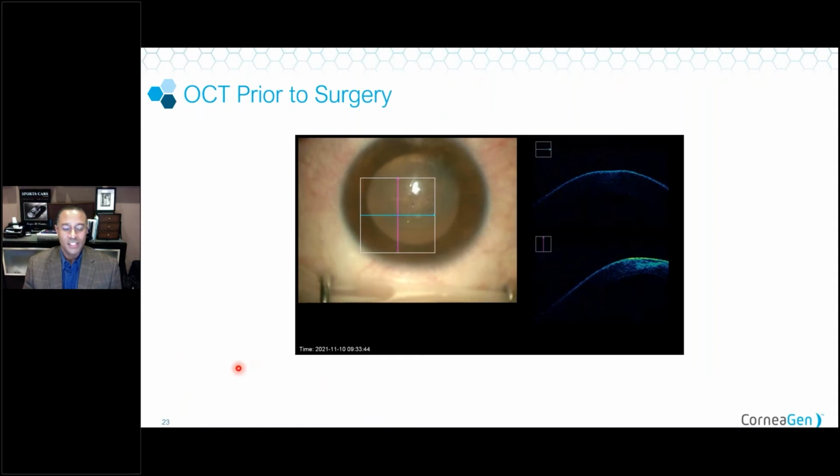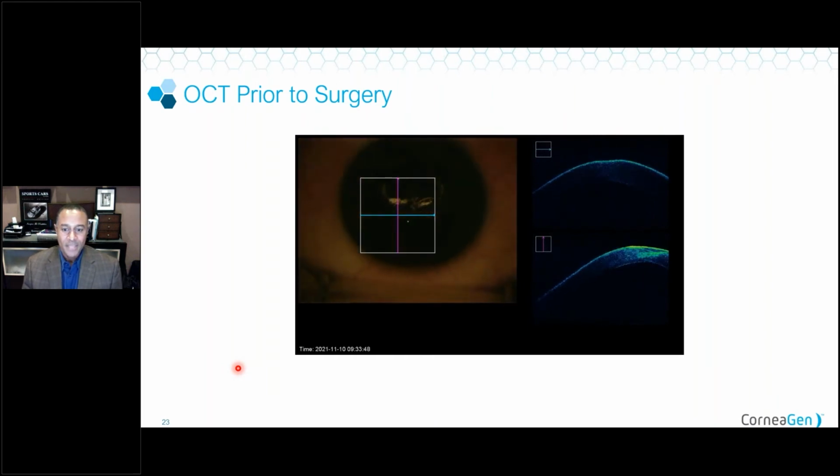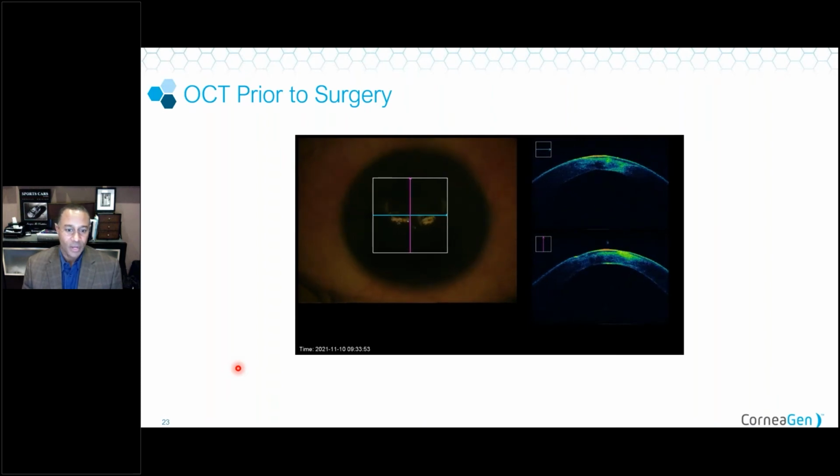So this is an OCT of that 33-year-old patient that we discussed. As you can see in the OCT run here, you can see the scarring in the anterior stroma, and you can see the thinning of the cornea at the apex. Next slide.